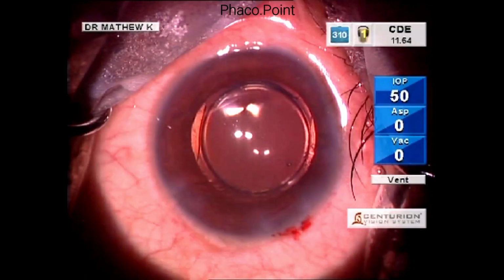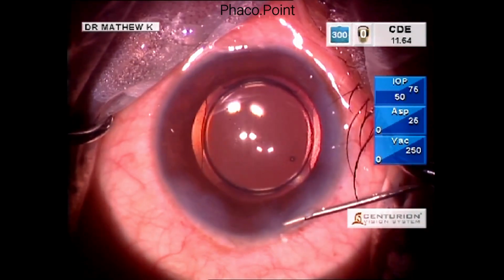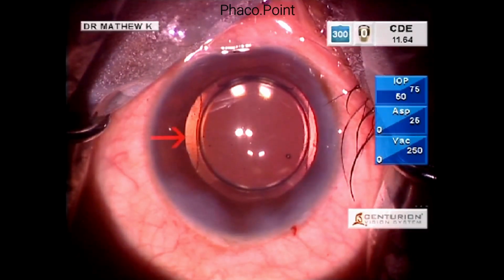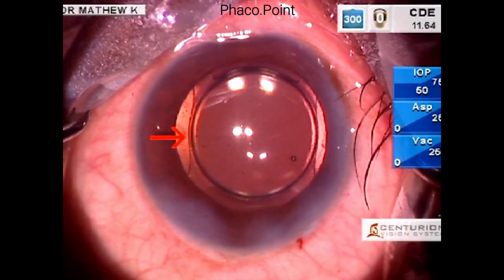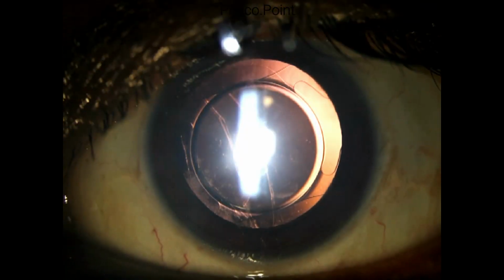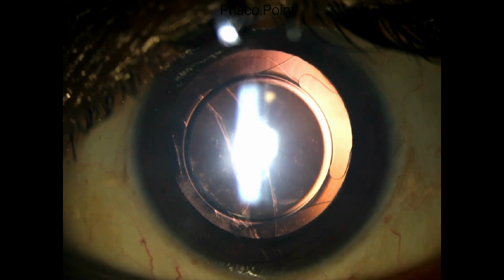The surgeon, while performing hydrodissection, has accidentally created an opening in the posterior capsule, which was missed at the time of the surgery. Day 1 post-operatively, during the rounds, the surgeon noticed that there is a classic opening in the posterior capsule. This possibly happened as a result of an aggressive stromal hydration.